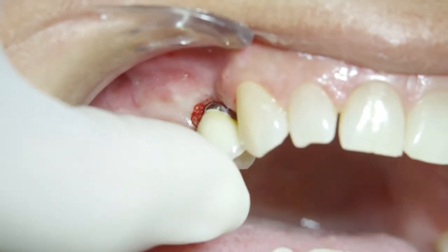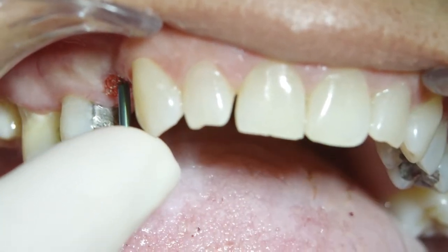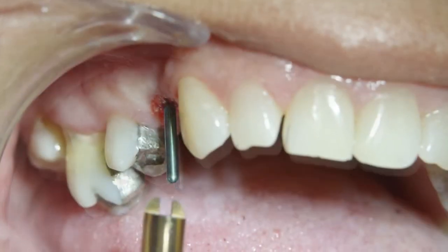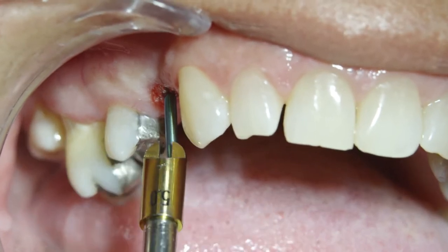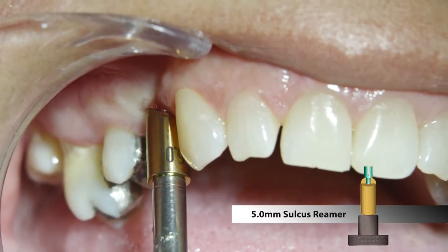After the initial seating of the IAC, a green three millimeter guide pin is inserted into the well of the implant. Then a gold five millimeter sulcus reamer attached to a threaded straight handle is slid onto the guide pin.